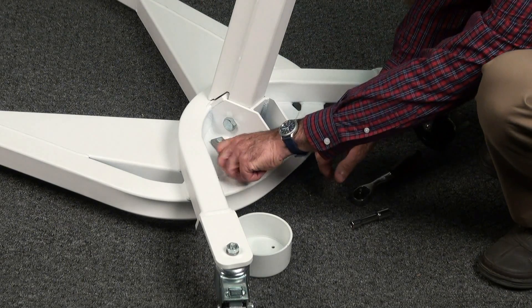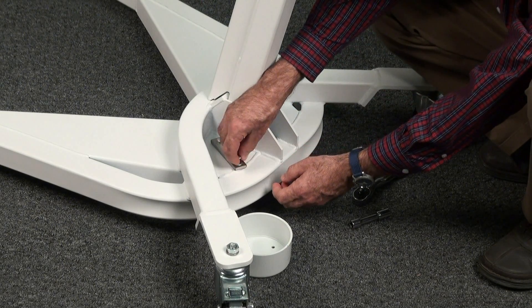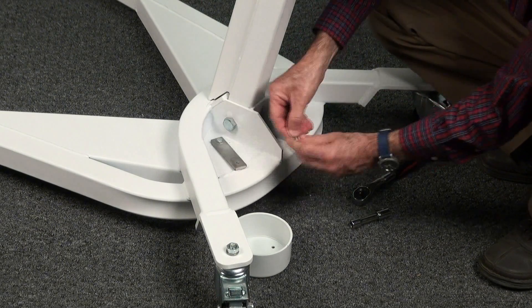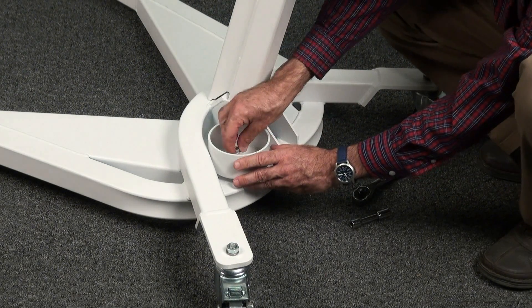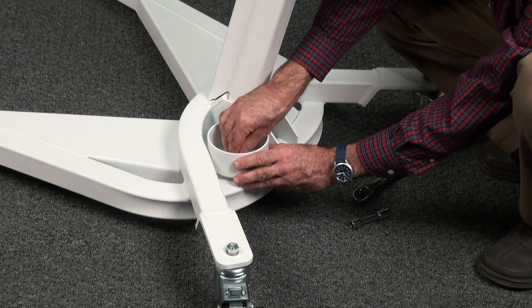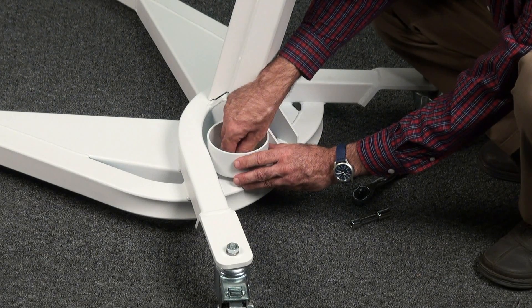Next, we'll add the stretcher cup to the base, which is designed to help secure the stretcher during transportation and storage. Remove the small bolt from the base, align the center hole in the stretcher cup with the hole on the mounting bracket, and replace the bolt.